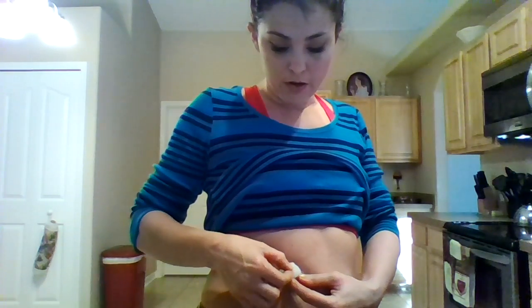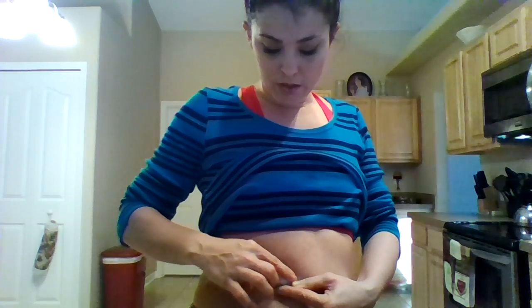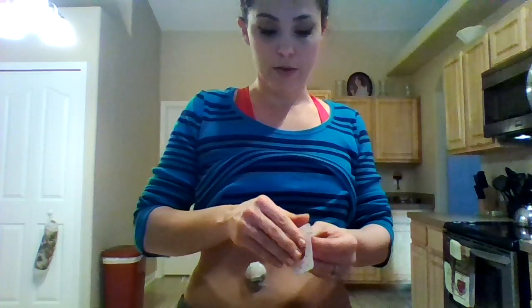and now we're going to fold that over the transmitter to hold it in place. I know a lot of people will just go like this, and there you go, it's done. This is where I say I use the double tape method because this is what holds it on for me.